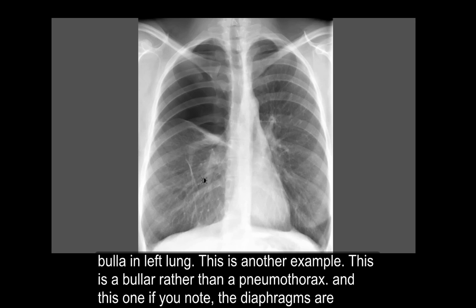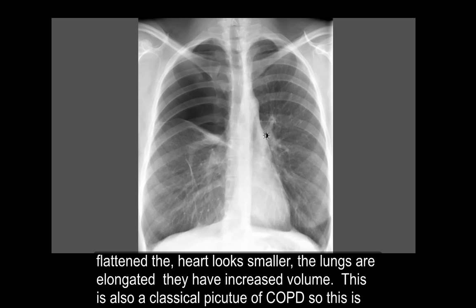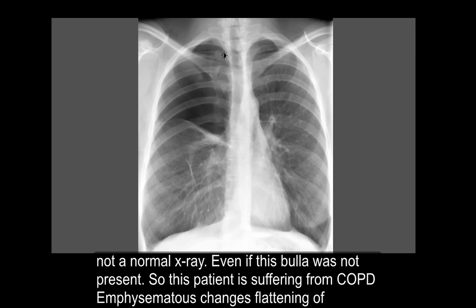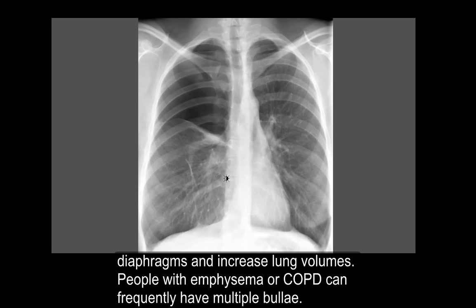This is a bulla rather than a pneumothorax. If you note, the diaphragms are flattened, the heart looks smaller, the lungs are elongated, and they have increased volume — this is also a classical picture of COPD. So this is not a normal X-ray even if this bulla was not present. This patient is suffering from COPD with emphysema changes, including flattening of the diaphragm and increased lung volume. People with emphysema or COPD can frequently have multiple bullae.